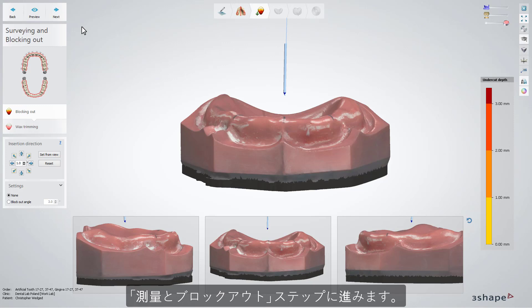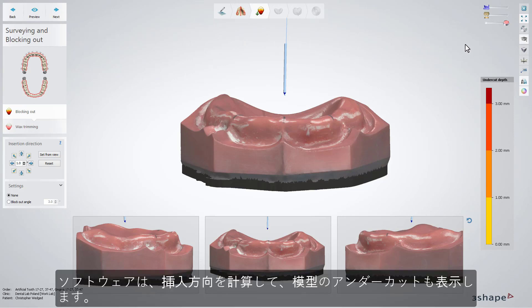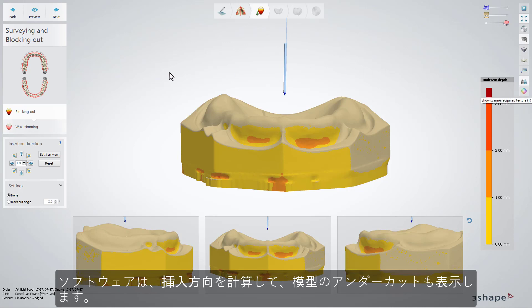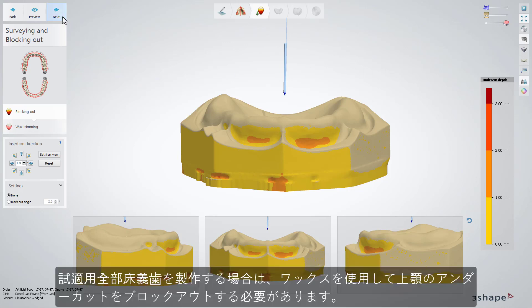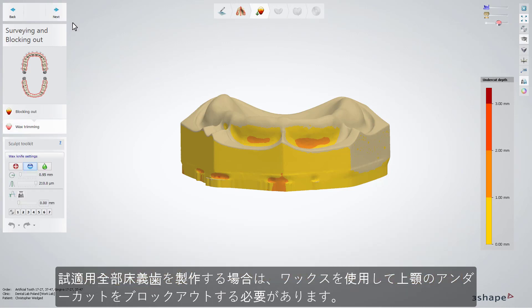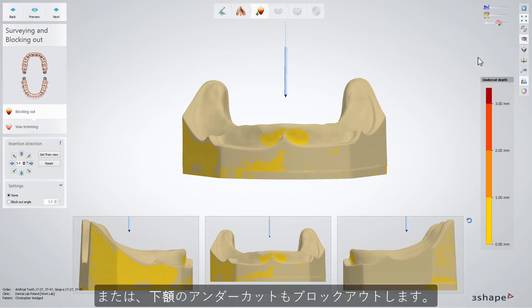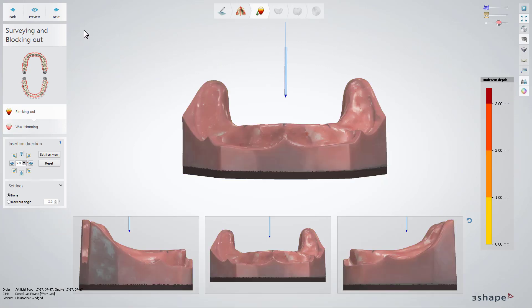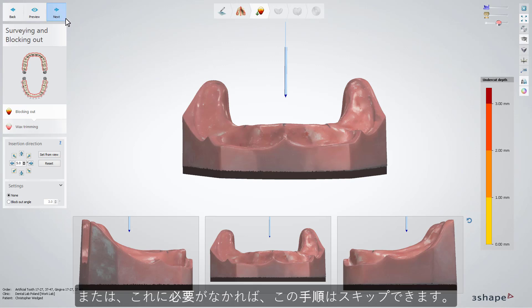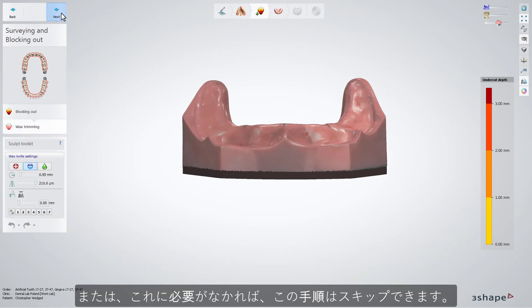Moving on to the surveying and blocking out step. The software will calculate the proposition for the insertion direction, also showing the undercuts on the model. If you are going to make a try-in denture, you might need to block any undercuts with the help of wax for the upper jaw, and next the lower jaw. You can skip this option if this is something that you don't need.